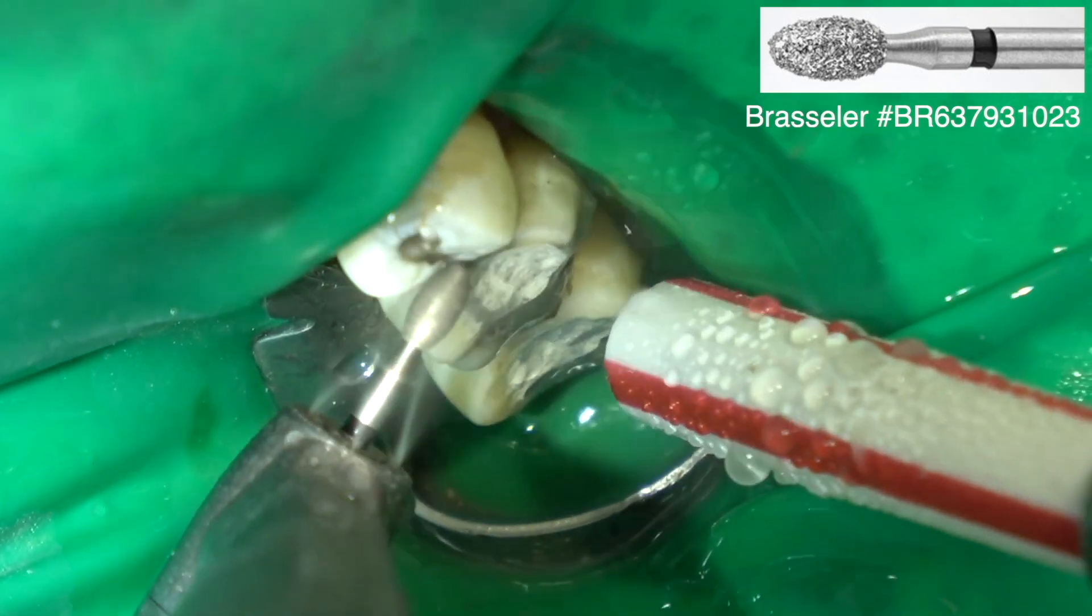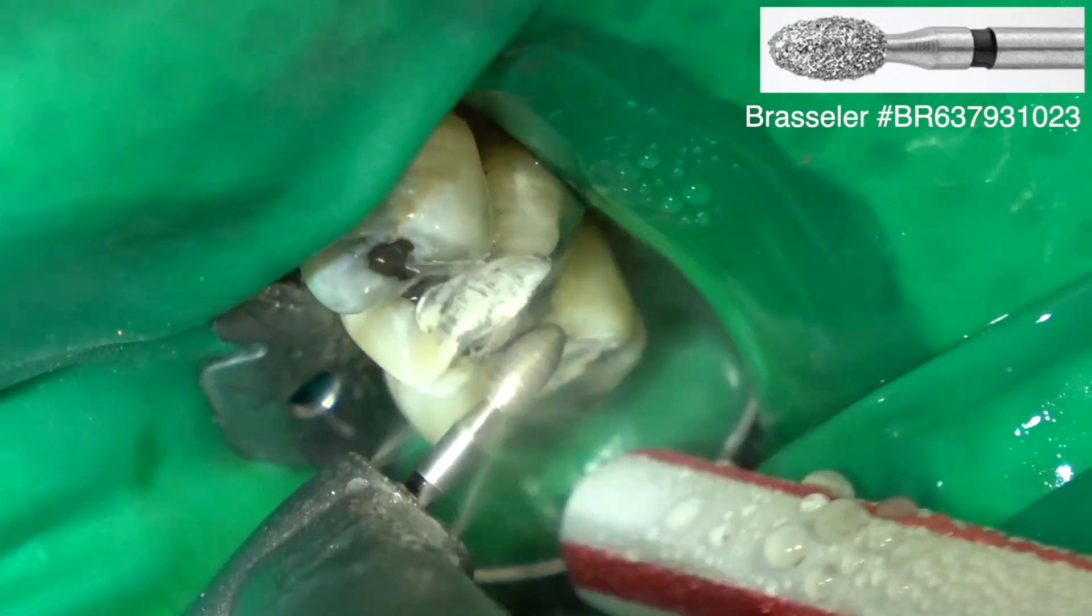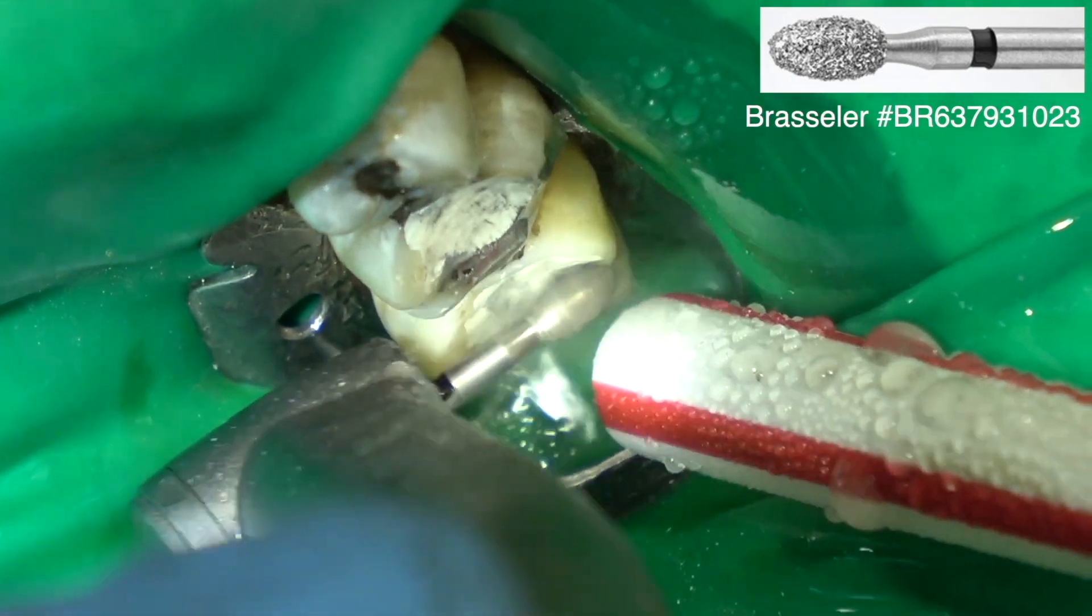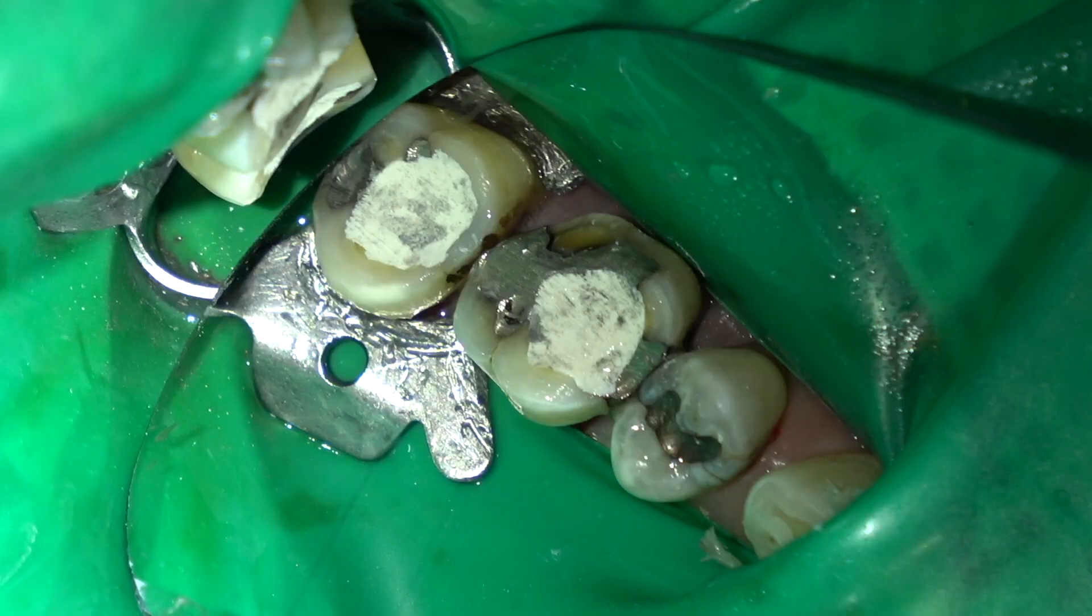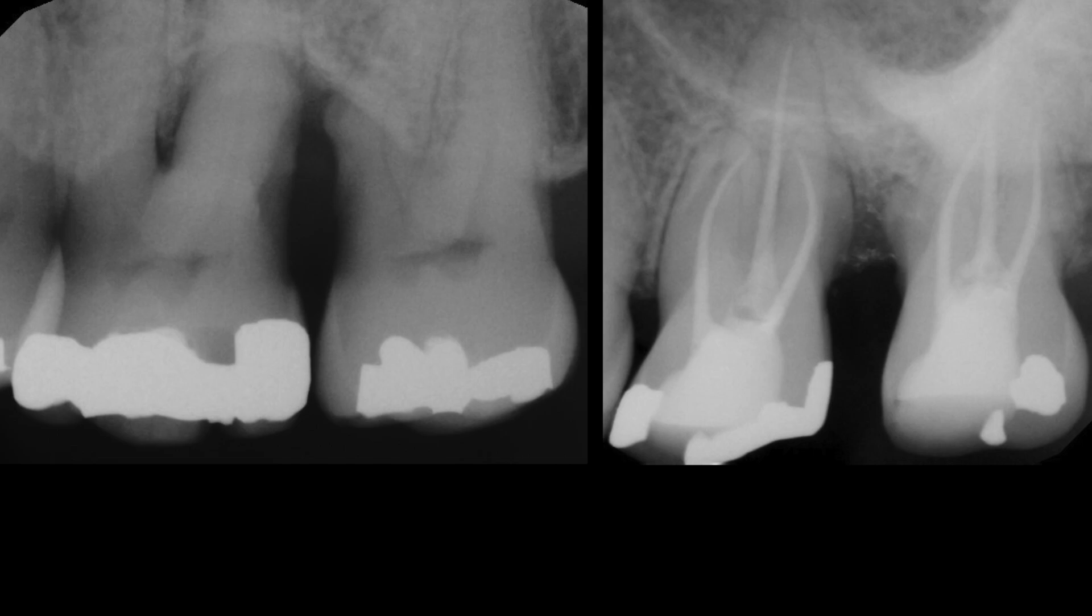This is just making it comfortable for the patient. You don't want to leave the IRM for a long time. It's not a permanent restoration, but it's fine for a few weeks. This is just the endose sequence.